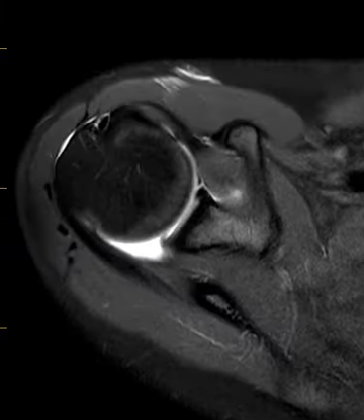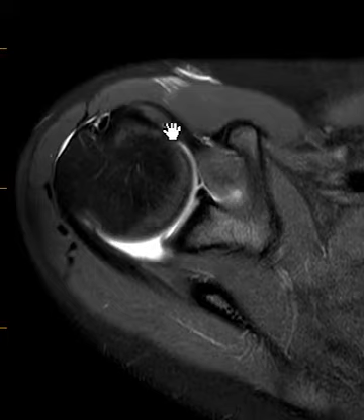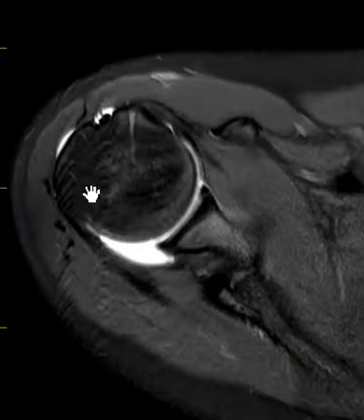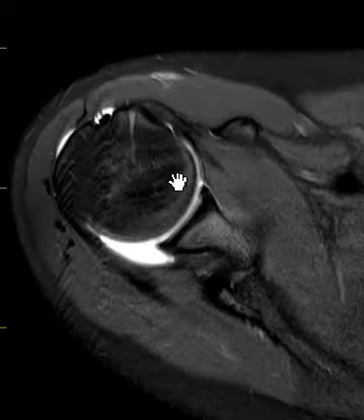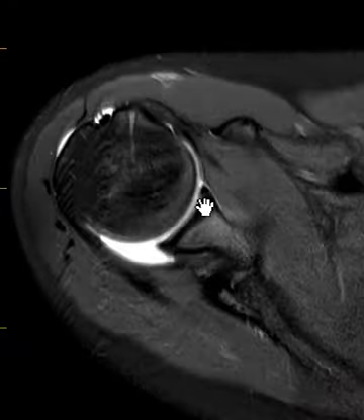With an arthrogram, we go into the front of the shoulder here. You can see some of the fluid in the front, and the contrast goes into the joint up here and fills it up. In this patient, we see a normal, round humerus. The articular surface looks great. This bone over here, the scapula, looks normal.